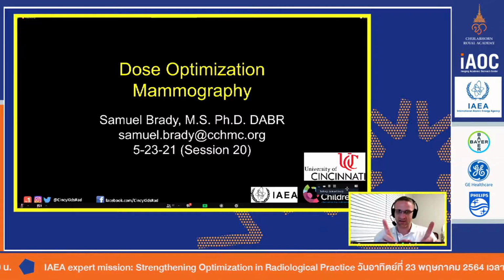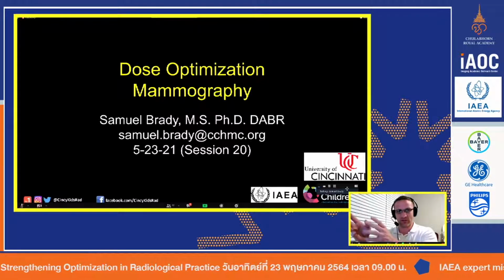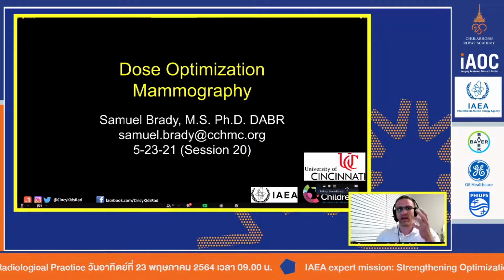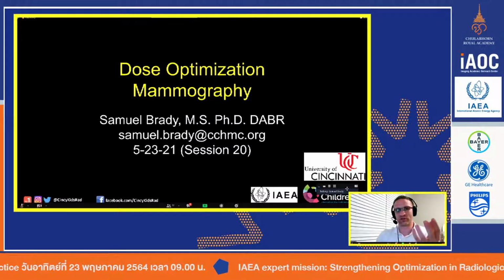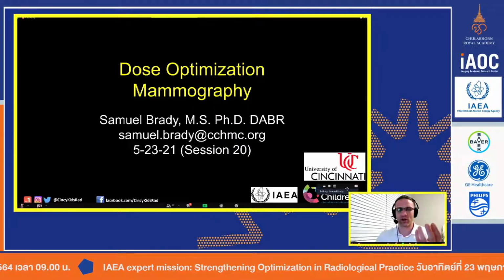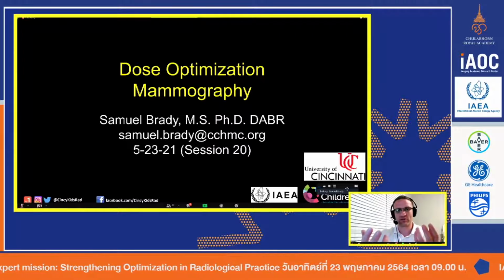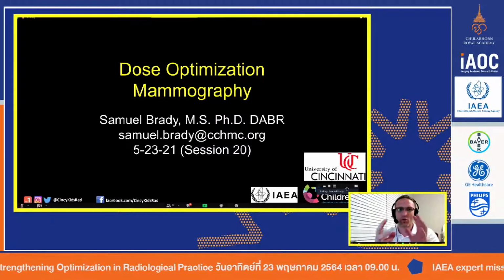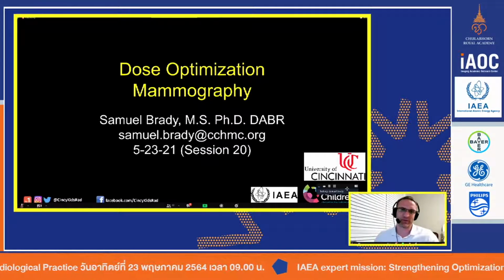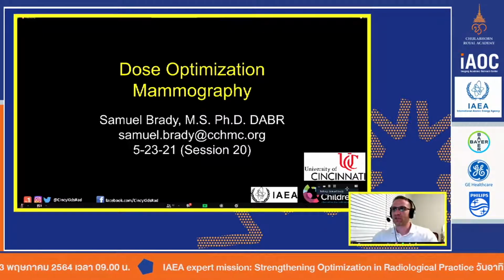That said, if you look at, for example, the reports from Hiroshima and Nagasaki, from all of the studies that we've been doing from the atomic weapons, they will give you lookup tables and plots based on effective dose and actual mean glandular dose. So you can actually use both. But most of the time when we talk about quote unquote risk, we usually talk about effective dose, which is in sieverts or millisieverts. So good question.